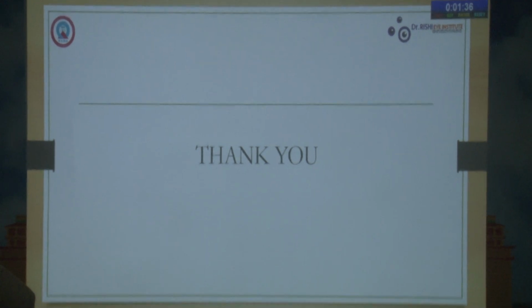Thank you very much for this presentation, but just a question: which type of EDOF IOL is available in India? Sir, EDOF IOL, like Appasamy, they are providing Super... No, I don't want the name of the company. Based on the mechanism... Pinhole effect. Pinhole effect, there has to be a hole in the center of the lens. So which type is available, whether spherical aberration based EDOFs are available or pinhole based? Mainly the pinhole.